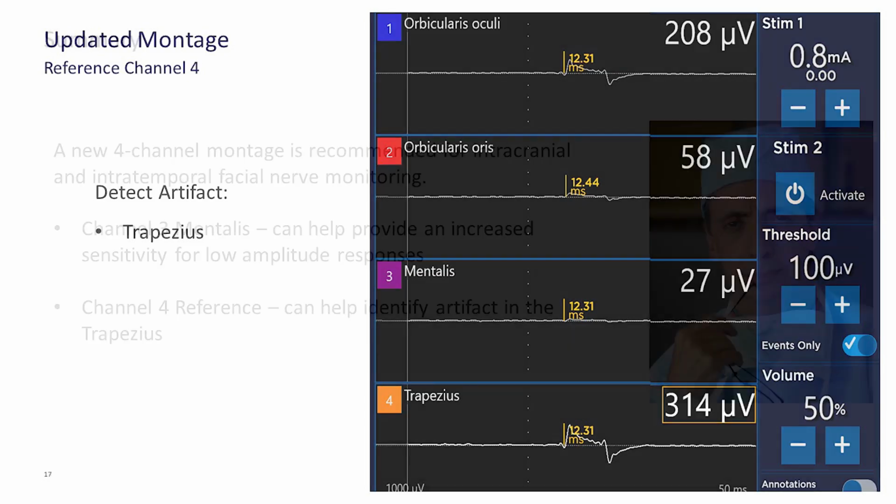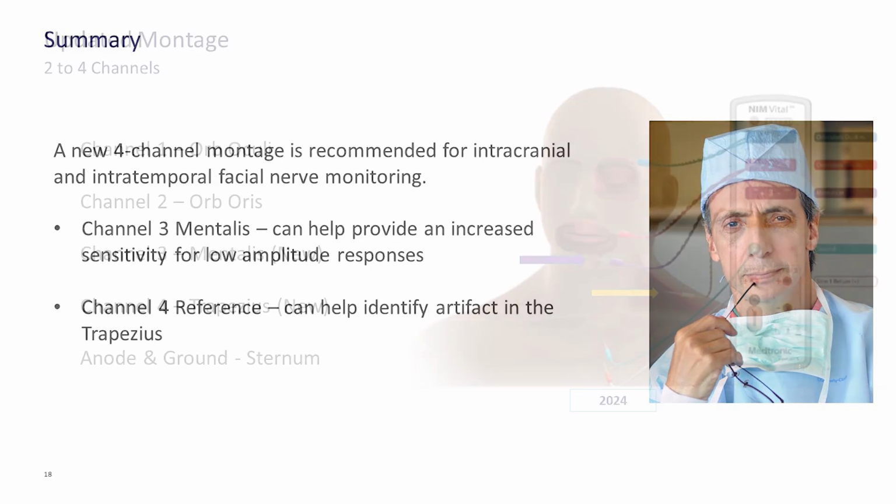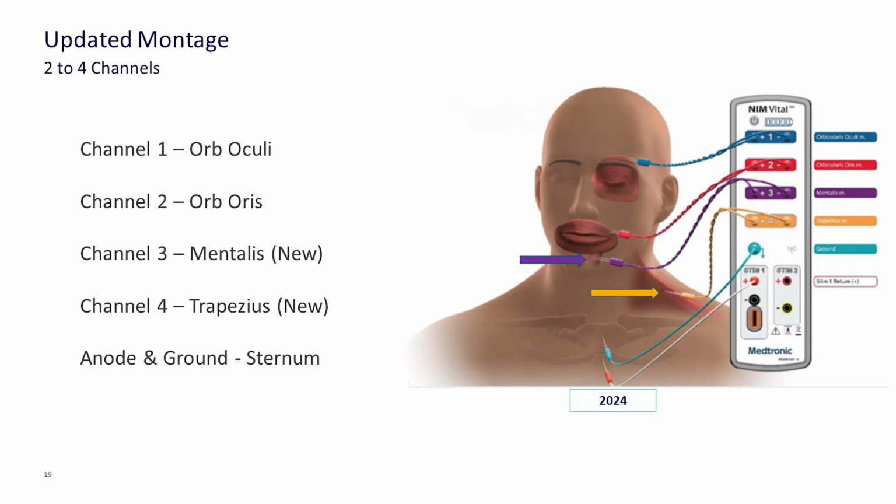You can see that the presence of nearly identical waveforms in the reference channel indicates artifact and not true EMG responses. In summary, with the availability of 4-channel monitoring, we strongly recommend channel 3 be used for mentalis muscle to provide increased sensitivity, and channel 4 be used to help identify artifact at the trapezius muscles. Rapid adoption of this new protocol at all centers is highly recommended to increase monitoring safety and efficacy.